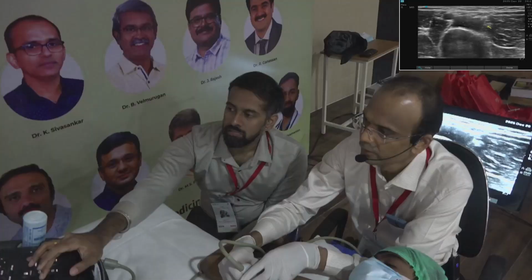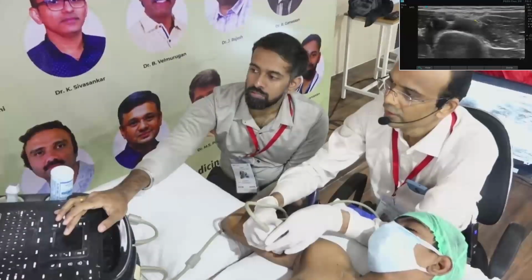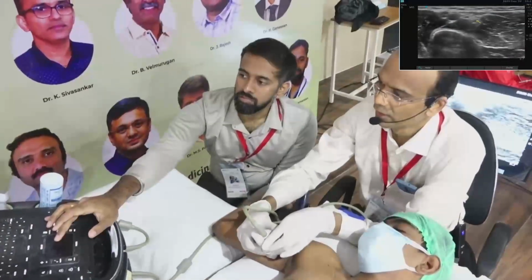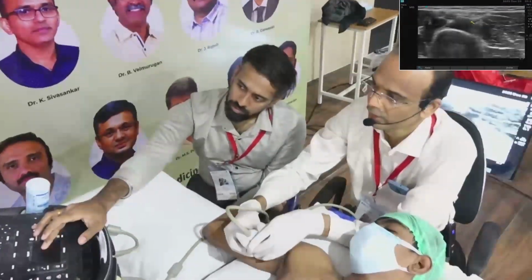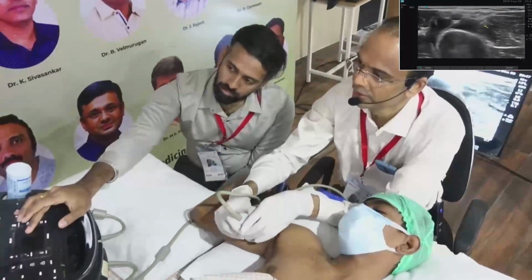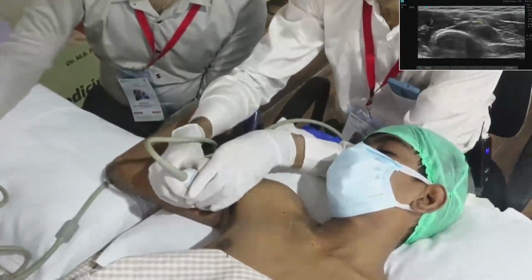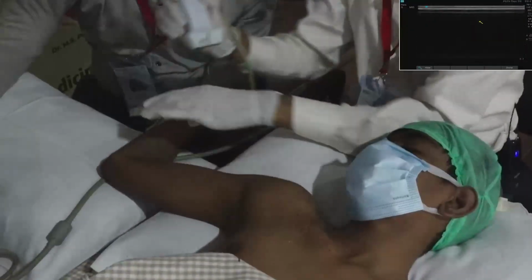While tracing the ulnar nerve, we are seeing the humeral head also. And if you see the humeral head, one more nerve component is coming and attaching along with the radial nerve, next to the ulna. Now we are seeing one more component coming from the humerus area and joining. That is the radial nerve. Okay. I'll come to the radial nerve again from distal.